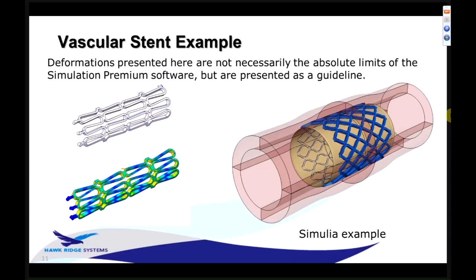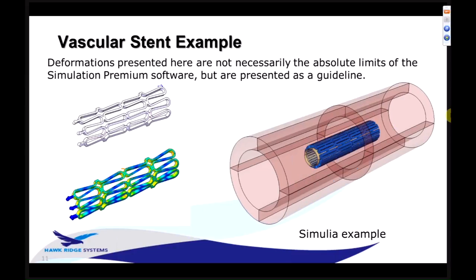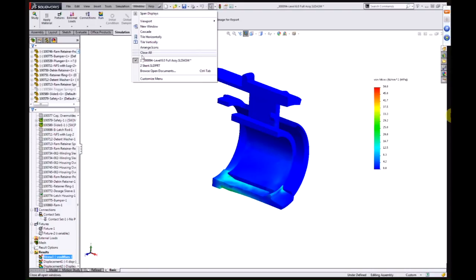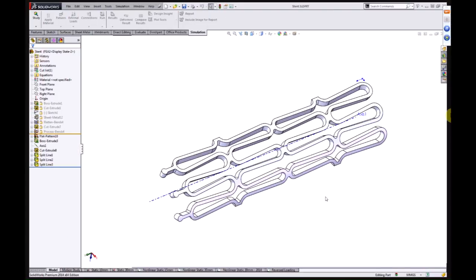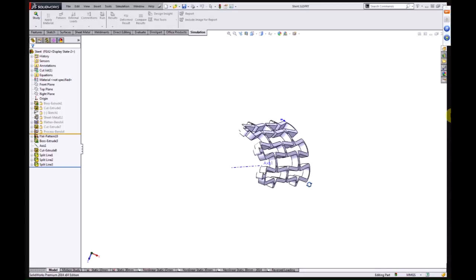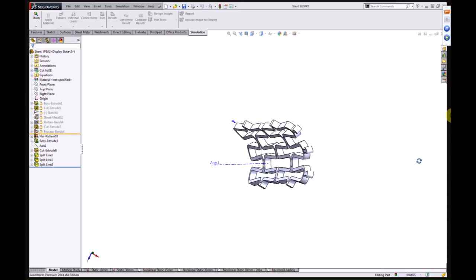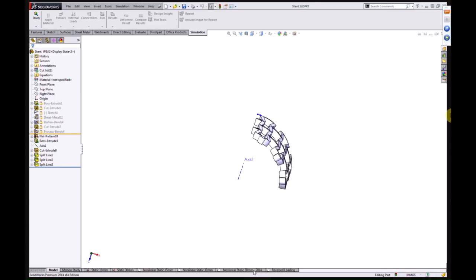To make things simpler, I cut it into a quarter of the true model. Actually cut it, just a quarter of the true model. So I'm only looking at a portion of it, and I've applied symmetry boundary conditions to the cut faces. Now I want to see how this part might distort if I expand it, and also if I compress it. It's going to happen in both phases of the behavior.